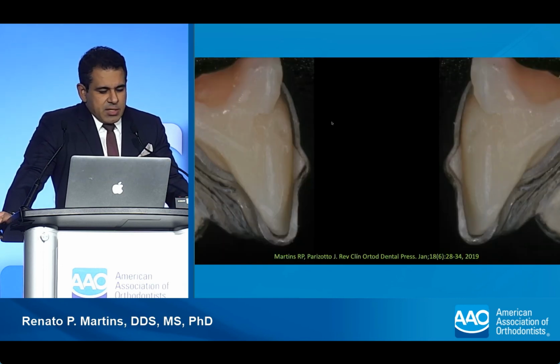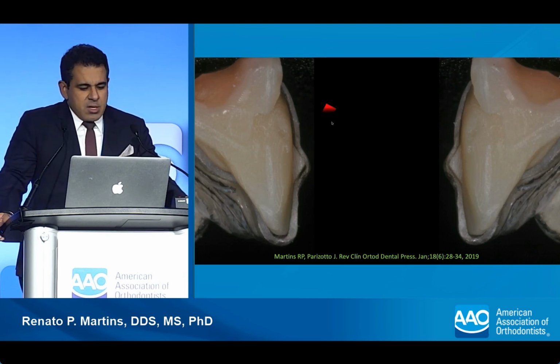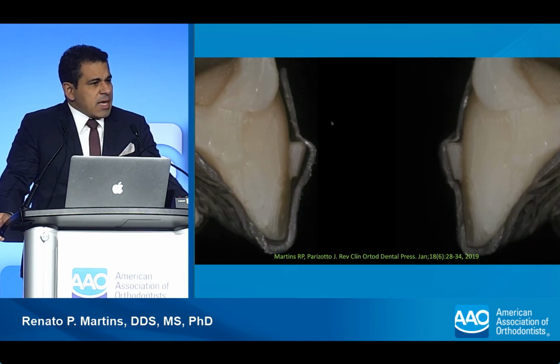They're going to be somewhat lingual, or with a lingual aspect of the force. So here you can see from an article that we published in Brazil, a picture of a passive aligner on the right side, and an aligner activated with 0.1 millimeters of extrusion. So there's a little loss of adaptation in the cervical. You can see the aligner is touching the attachment, but the direction of the force is not only extrusive, but is also lingual. And it doesn't matter if you increase the area of the attachment.